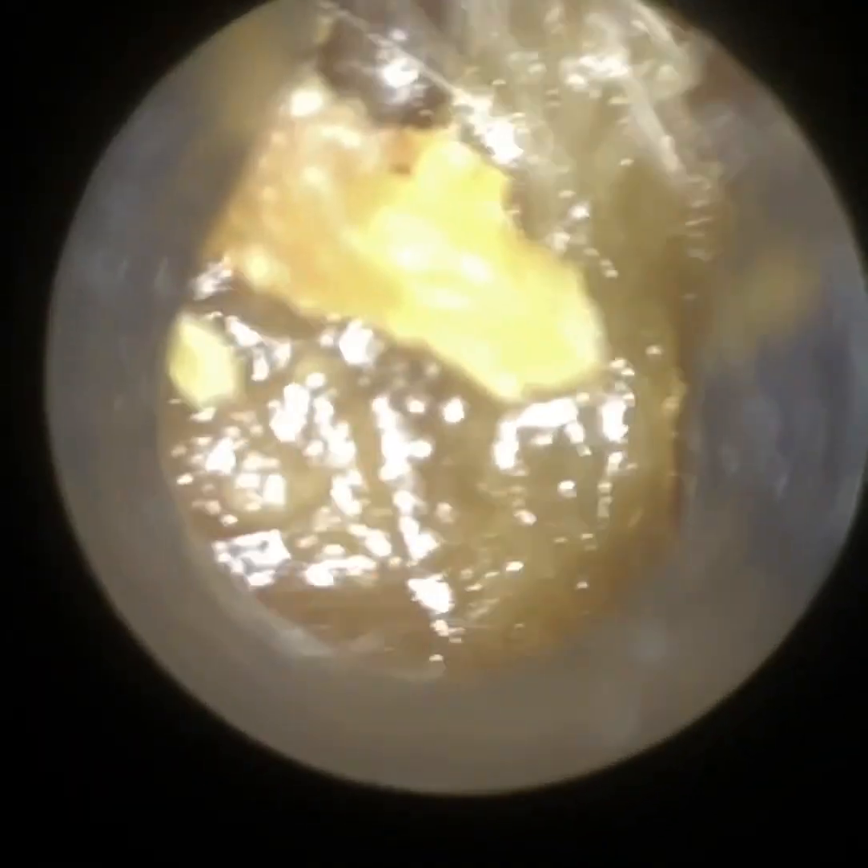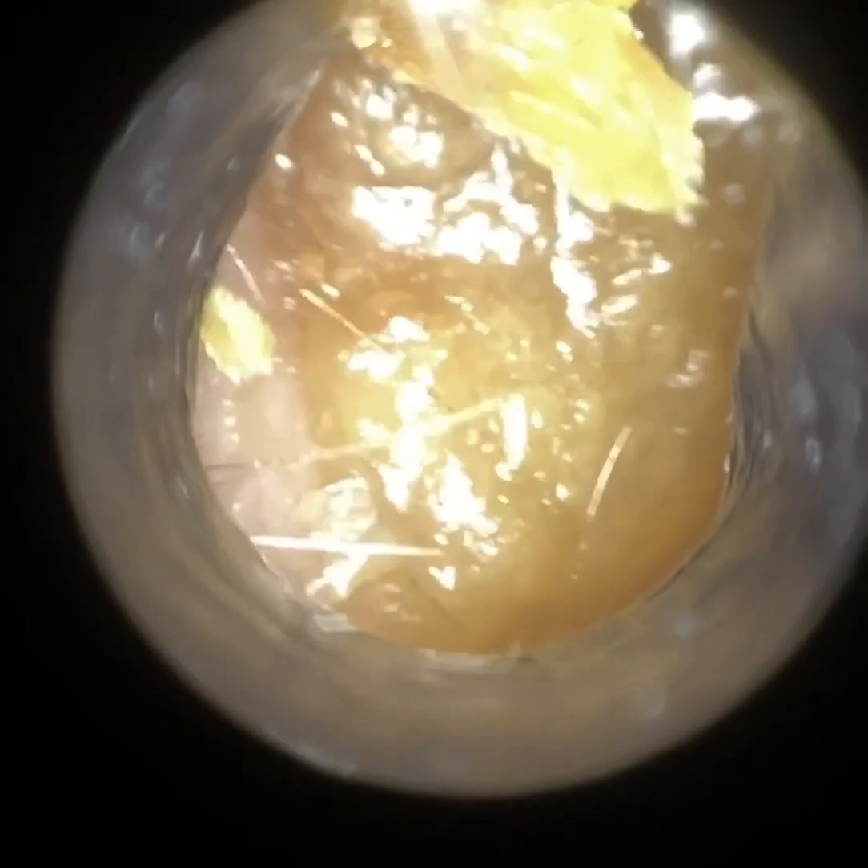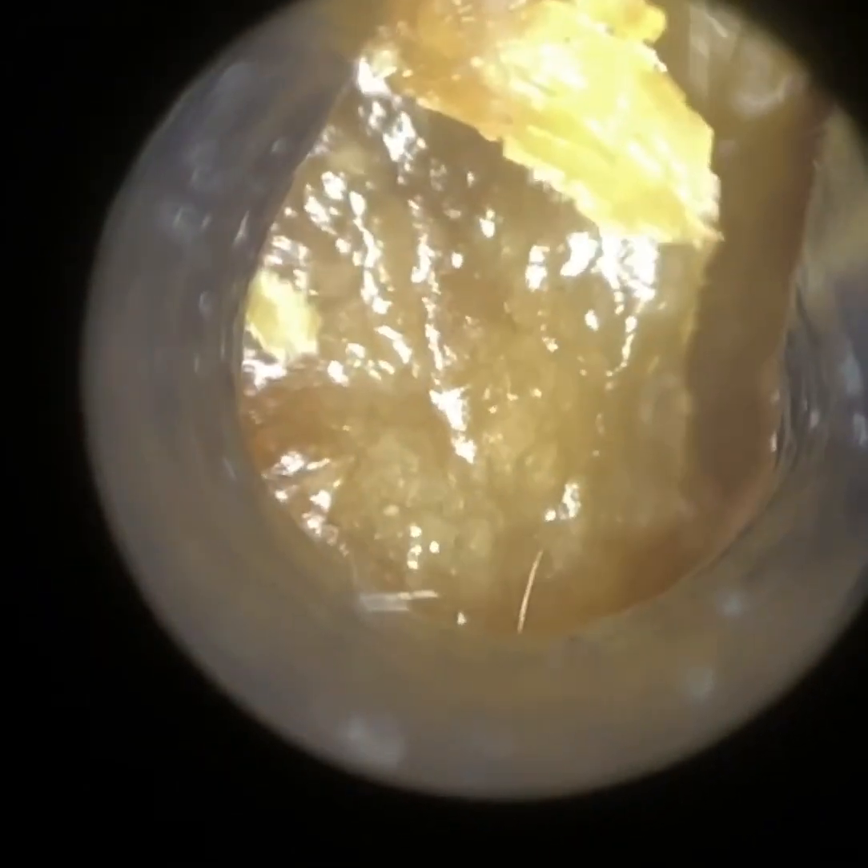You're not having to lean forwards and reposition your body, so it's less strenuous. It puts less strain on your back, neck and your arms compared to when you're using a microscope or loops, for example. So this is the patient's right ear now. They reported a bit of tenderness at the entrance — the entrance of the ear was slightly tender, with a bit of edema, a bit of swelling.